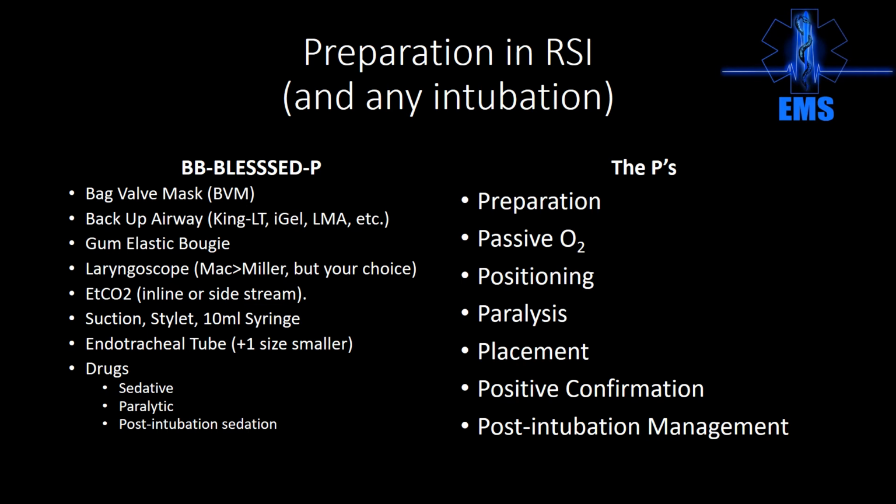You need breath sounds present on both sides, or you need to make sure that you didn't go too deep and drop a right mainstem intubation. You need absence of breath sounds or absence of air over the epigastric area. And ideally, you should be able to have a recorded video laryngoscopy view showing that that tube successfully negotiated the cords.